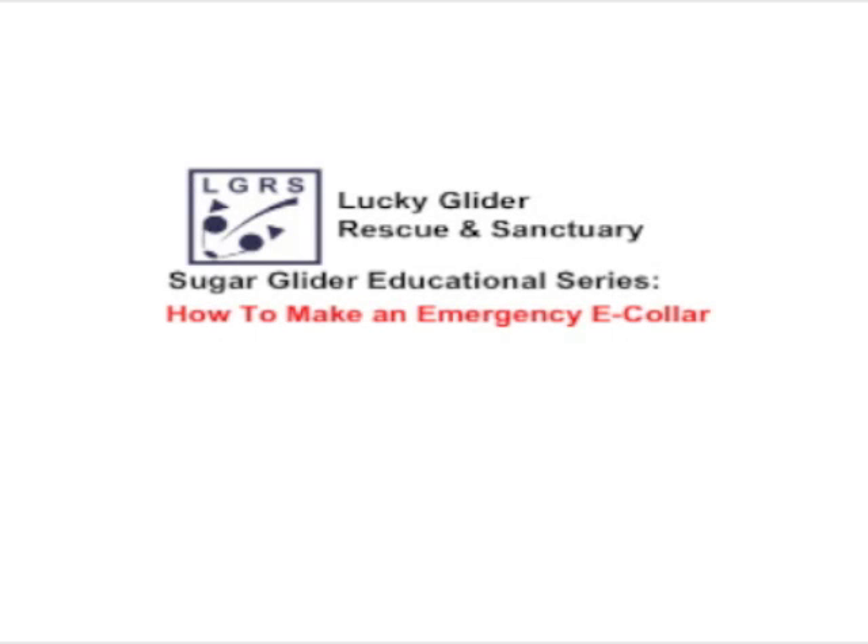Hi, this is the Lucky Glider Rescue and Sanctuary Educational Series, and this video is specifically on how to make an emergency e-collar.